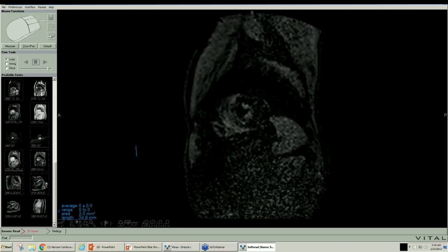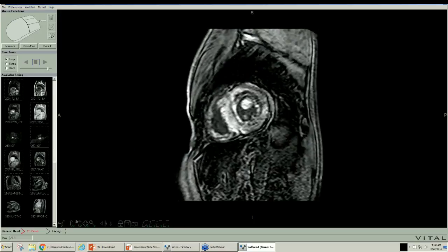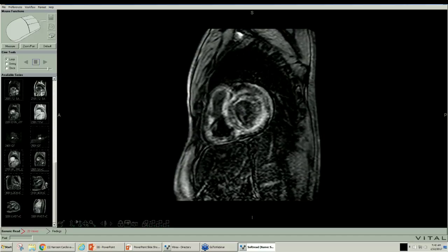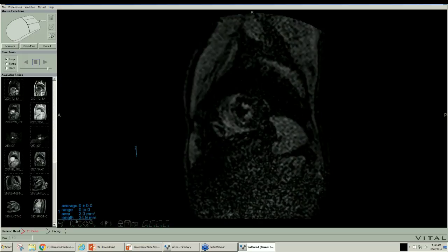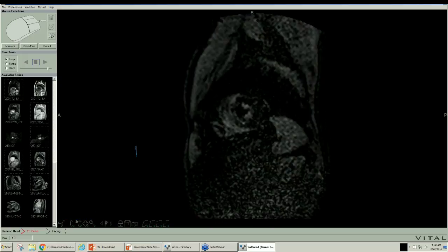Still difficulty nulling it. So let's look at the images after it's nulled, after late gadolinium enhancement. Since we did have trouble nulling it, we believed what we had, because we had a new coil and everything functioning correctly. We nulled the patient before, nulled the patient after, and so we had difficulty nulling this one with the Look-Locker, where this is supposed to be totally black, and see, I can't make it totally black. So this is the problem.